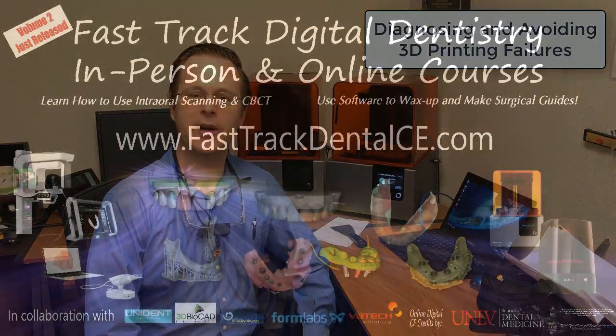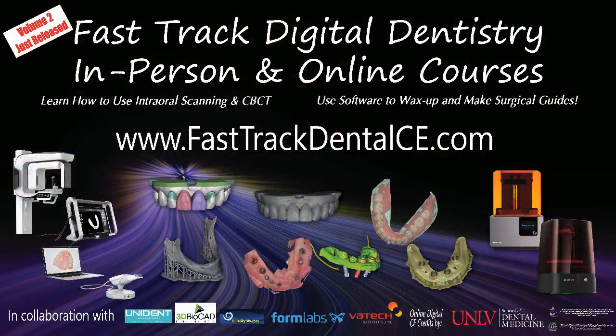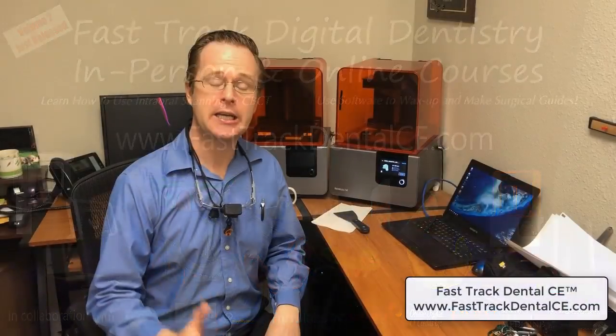Hey everybody, this is Dr. Michael Shear with Fast Track Dental CE. I wanted to share this informational video because I had a rare occurrence with my 3D printer — I had a printing failure. I wanted to show you how I work through it, how I manage it, and how we improve on it so we don't have a failure again in the future.